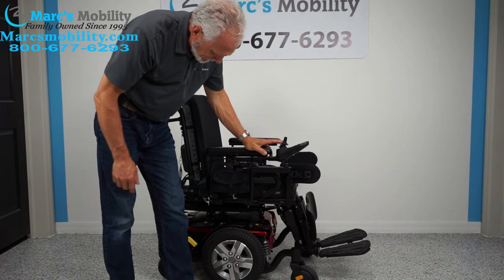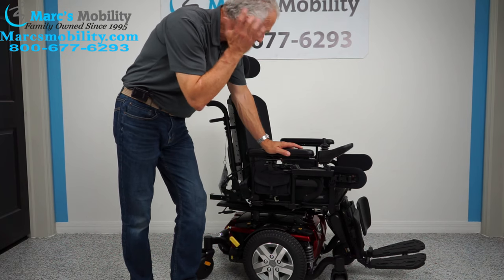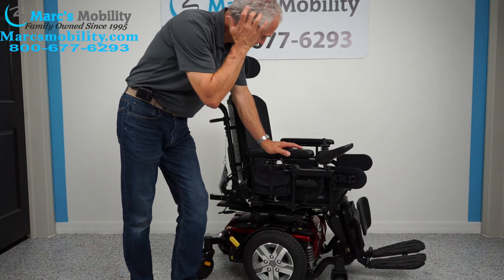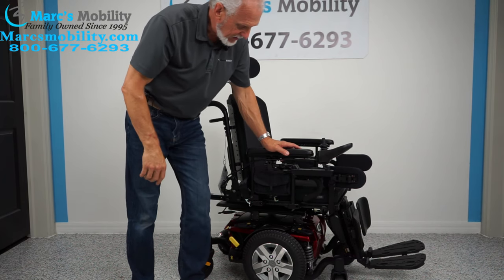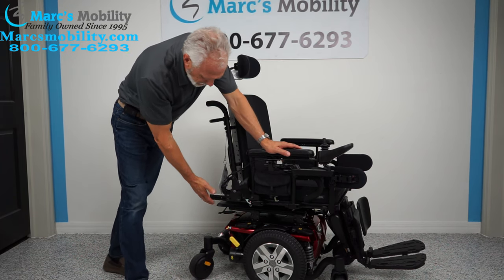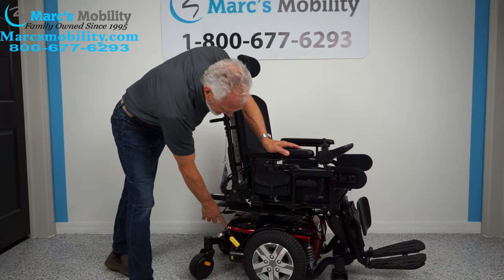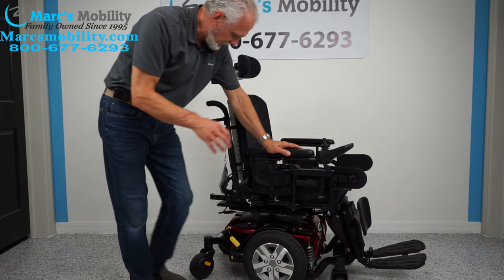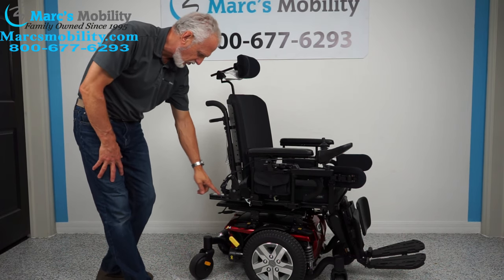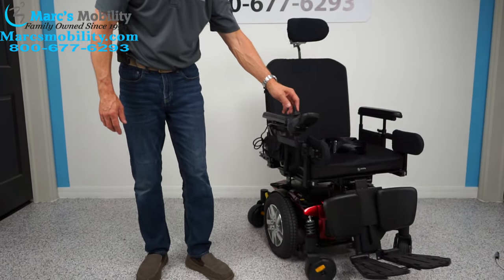This chair has a 300-pound weight capacity. Even though it has a big 20 by 20 seat, the seat will stay on as-is — we're not changing it. If you're looking for a really nice, practically brand new power chair, this is the Jazzy J4 by Pride Mobility. The total weight of this chair is 351 pounds, as shown on the sticker. It's ready to go and it's gorgeous.